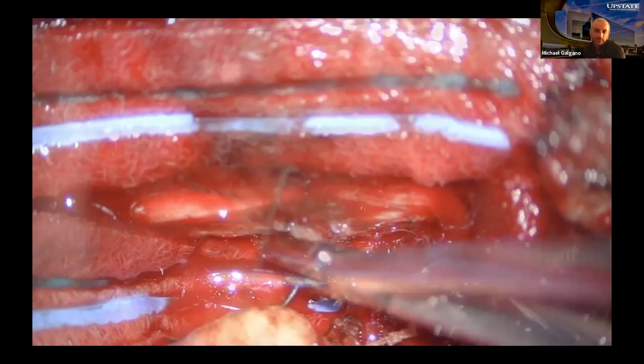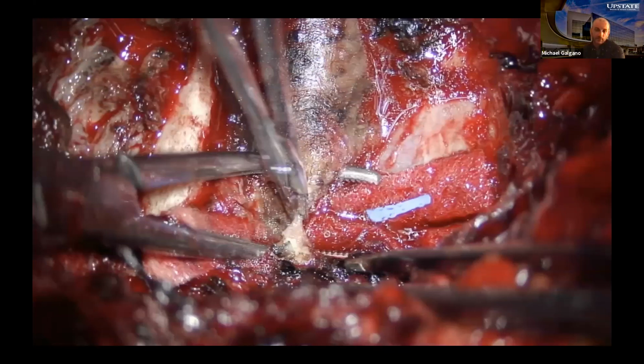Here, getting a right angle, we'll bipolar. This is the lateral runoff of the T10 nerve root, which we sacrificed here. Now at this point, it's really just dissecting this off the pleura.